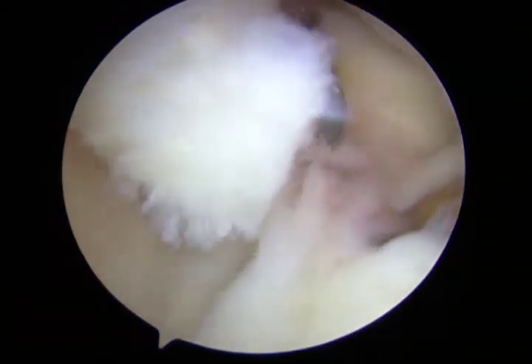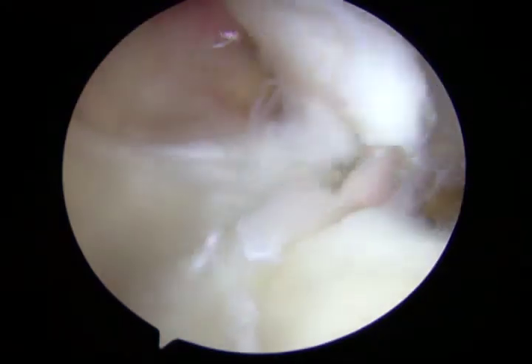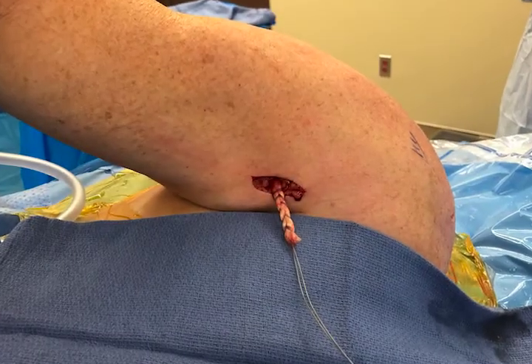Once the biceps is completely released, the remainder of the planned surgery is executed, whether that be work in the subacromial space, leaving the tenotomy as the final biceps treatment, or performing an open bicep tenodesis, which is what we prefer.